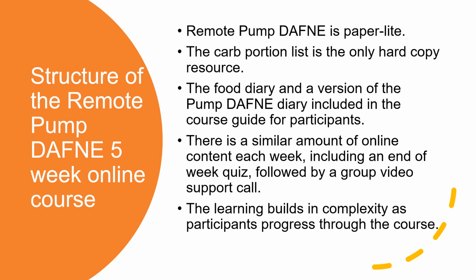In line with the direction of travel of the NHS as a whole, the remote Pump DAFNE course is paper light. The only hard copy resource participants require is the carb portion list. If participants are interested in fat and protein content of foods, they may wish to refer to the carb and calorie counter for fat and protein content.